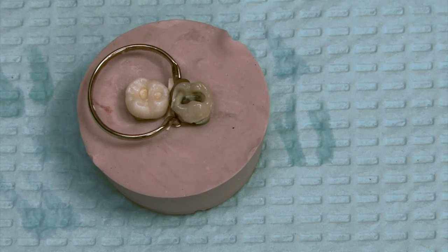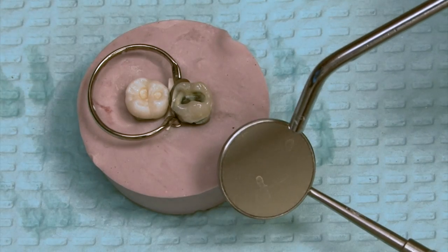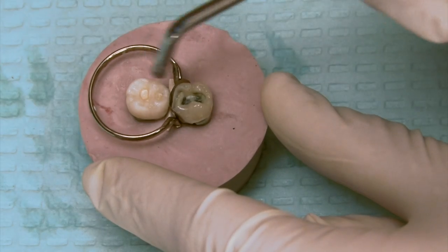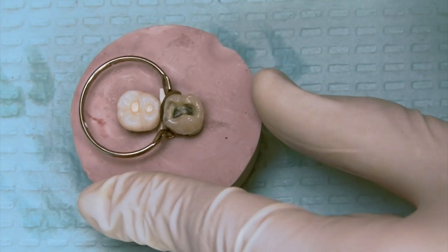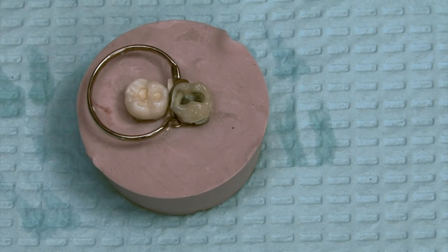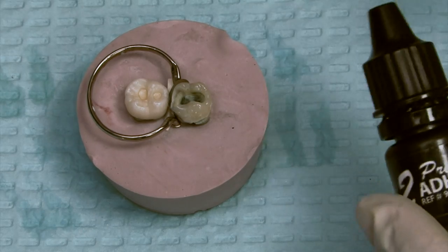Just trying to remove the excess so there's no puddles. Then we're going to go in — again, test the air-water tip. We're going to thin out this material. We're not here to blow the material off, we just want to thin it out. We want that just barely moist appearance, a slight glisten.